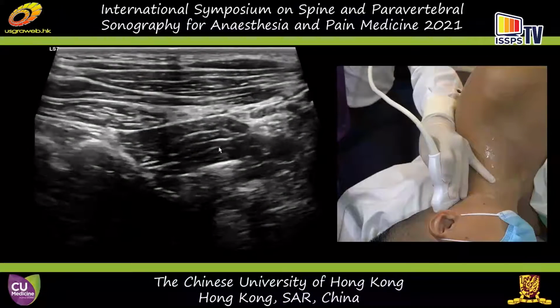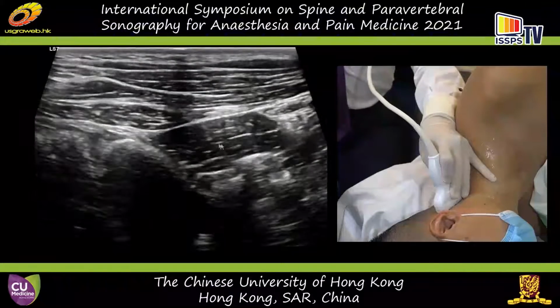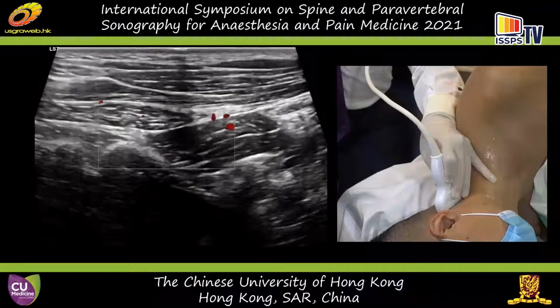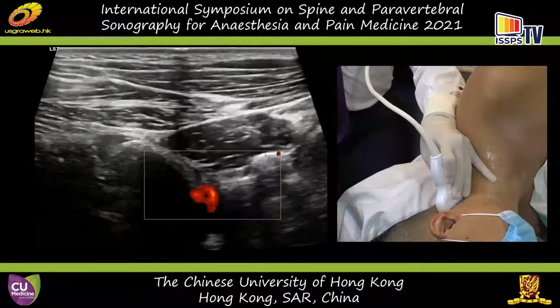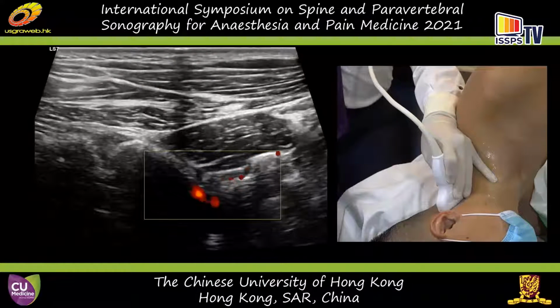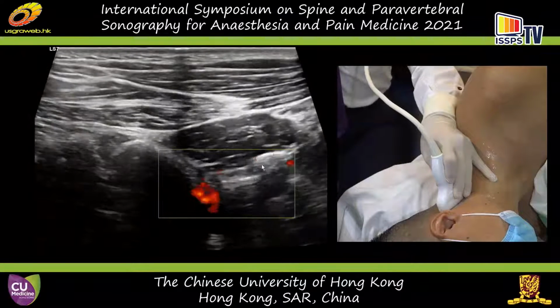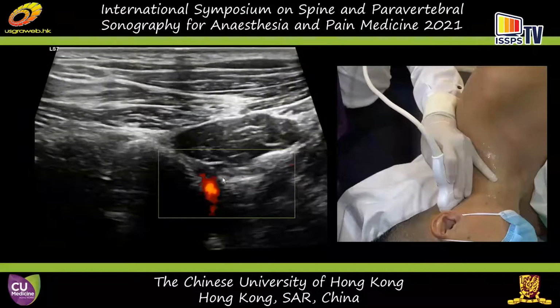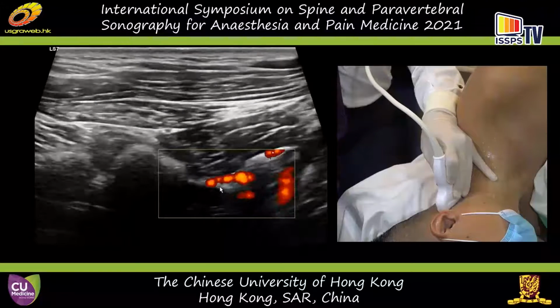You can see 2 of that. And when you see the artery underneath the obliquus capitis inferior muscle, in fact, this is the vertebral artery again, which is just getting through the transverse foramen for this C2. And then also the C2 nerve root is underneath that and medial to the vertebral artery. So this is the C2 nerve root coming out from here.